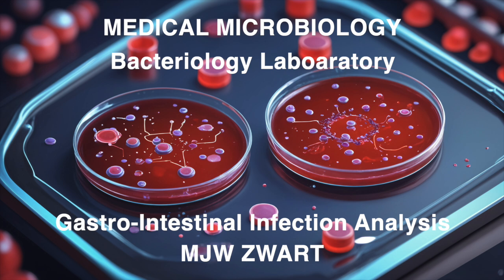A 30-year-old patient, watery diarrhea, abdominal cramps, no recent travel, no fever, no blood in the stool. But the GE-PCR panel is negative. So none of the usual suspects. What do we do when the PCR doesn't give us an answer? Well, now that personalized roadmap is even more important. We need to think about those rarer causes of gastroenteritis, the ones that might not be on that standard PCR panel. So thinking outside the box a little. Exactly. In this case, because it's watery diarrhea and there's nothing else going on, we might suspect Aeromonas or Plesiomonas. They're often found in contaminated water.